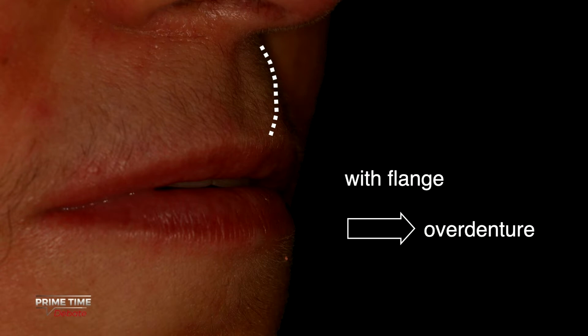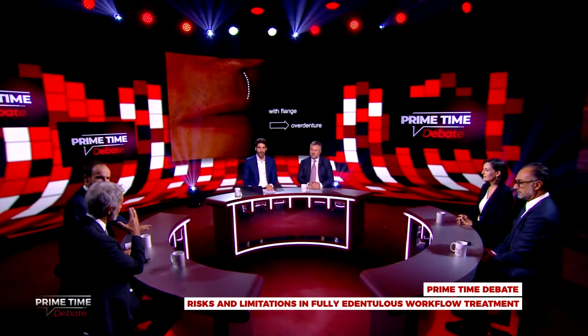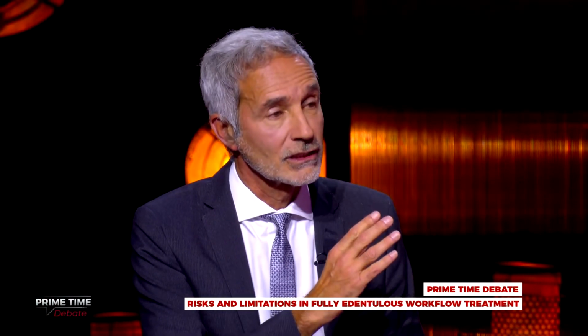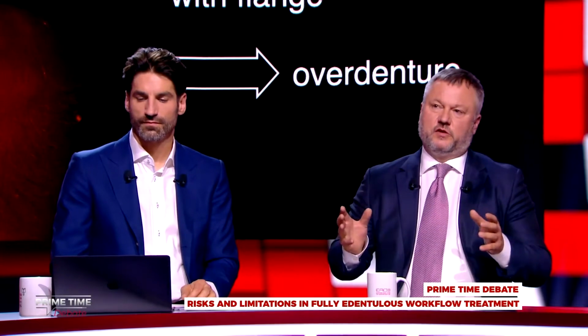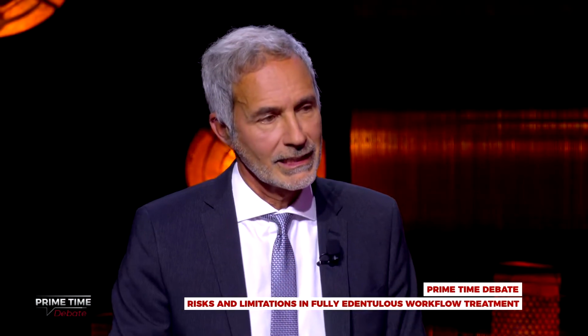In this case, the patient asked me for a fixed one, but after seeing this pre-evaluation, she decided on a removable one. But I see you are still going for the traditional analog way of setting up the teeth. Yes, I have to say that I will show this in a case later.